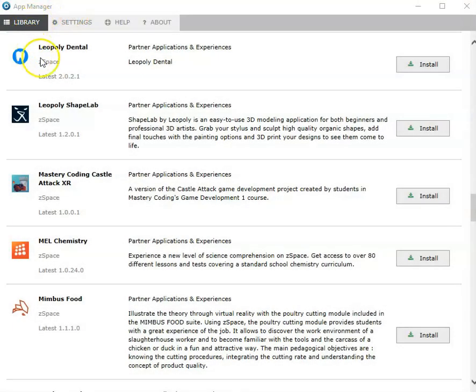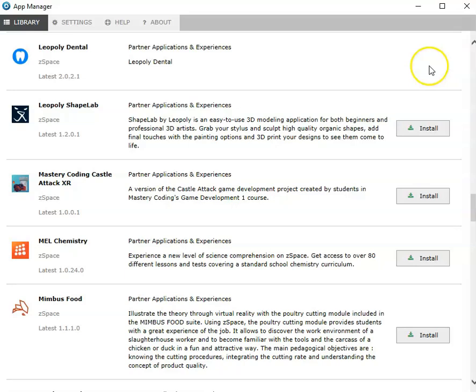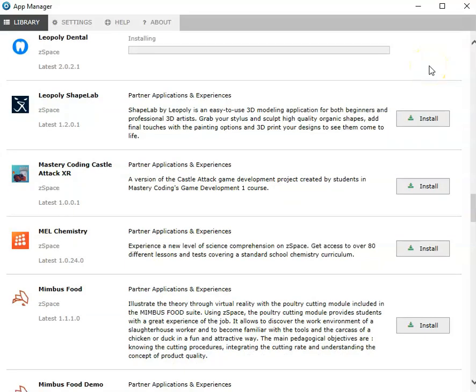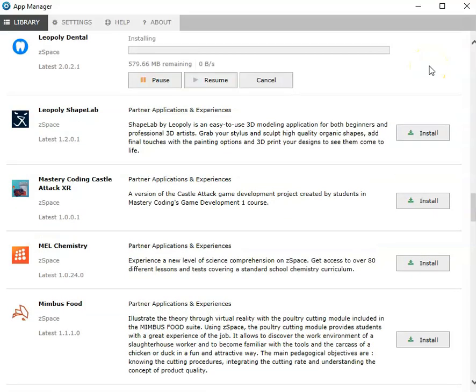How to license Leopoly Dental. Once you've retrieved your license keys at zspace.com, head over to zSpace's App Manager to install Leopoly Dental.